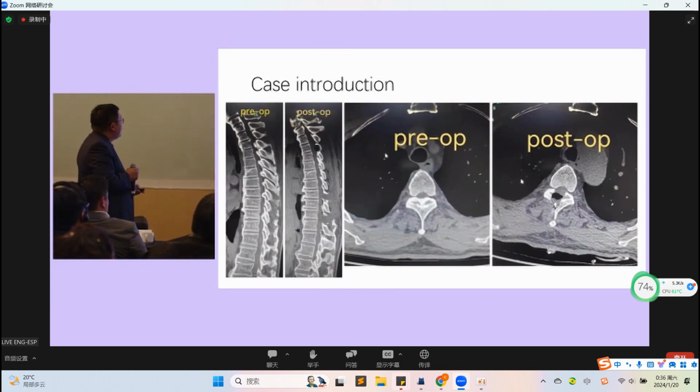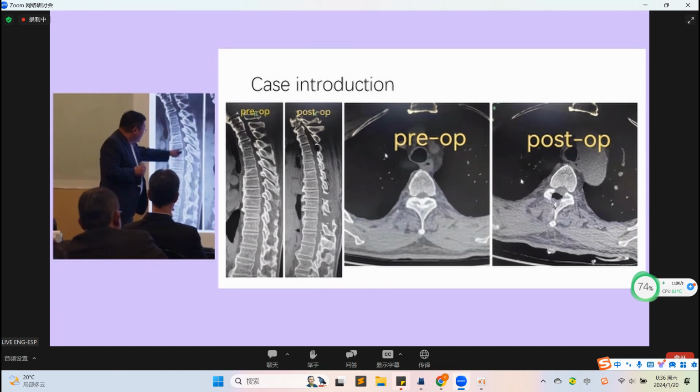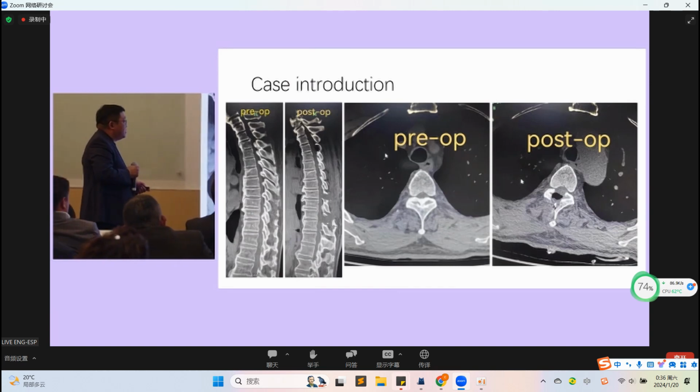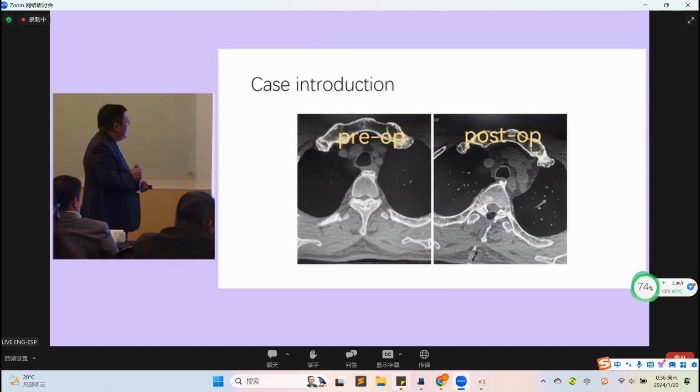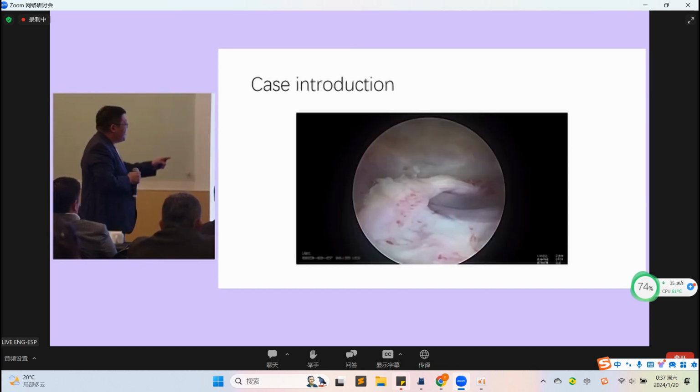Case introduction. This case is a difficult case, maybe 5 levels of OF. I finished the 5 levels decompression at the same time. Have click the video. Very severe.